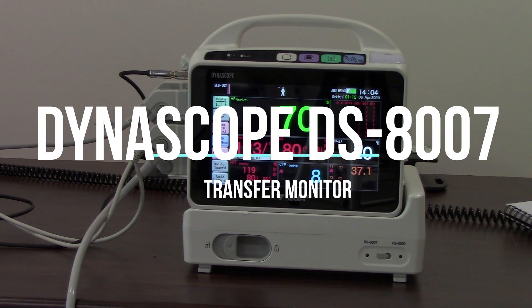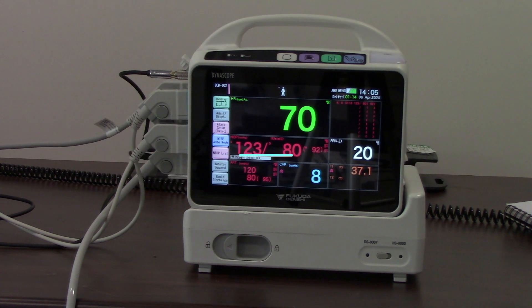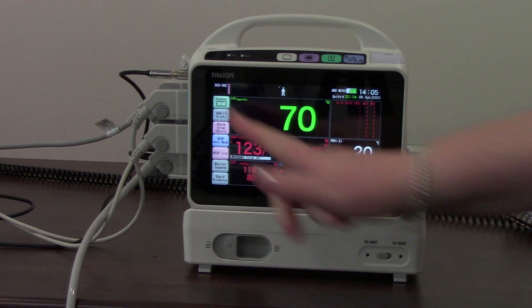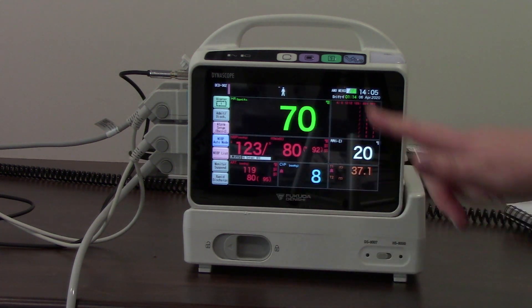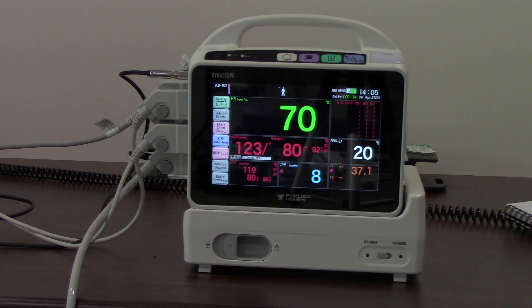Welcome to this short training session on the DS8007 transfer monitor. We are going to look at the keys along the top of the monitor, then have a look at some of the user keys and some of the parameter functions as well.